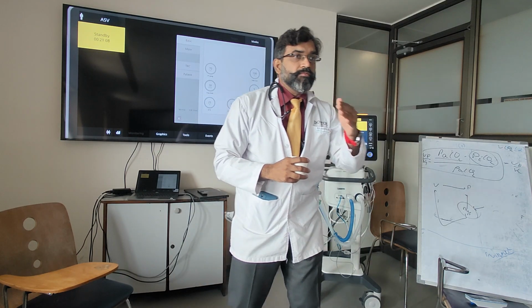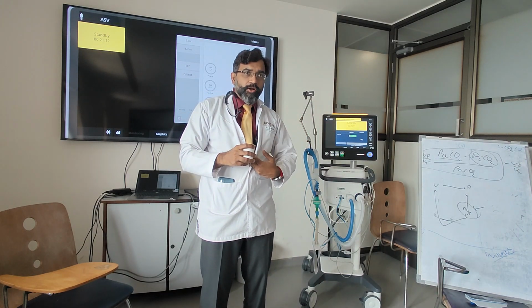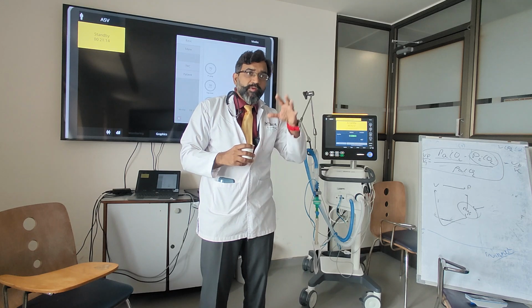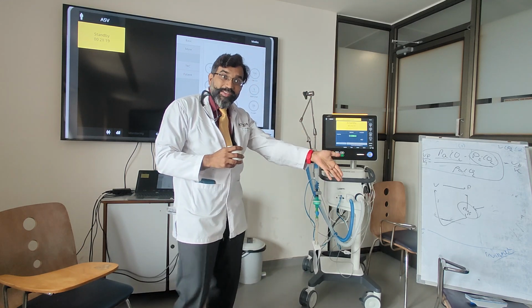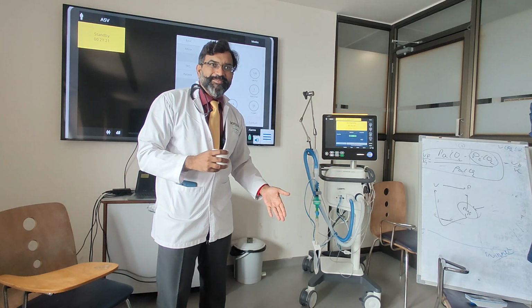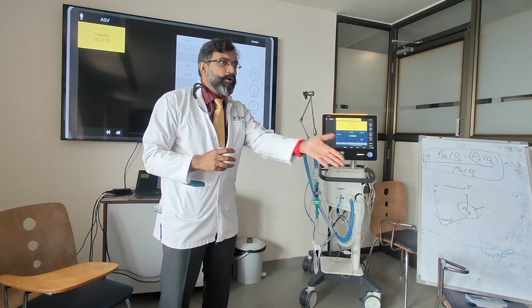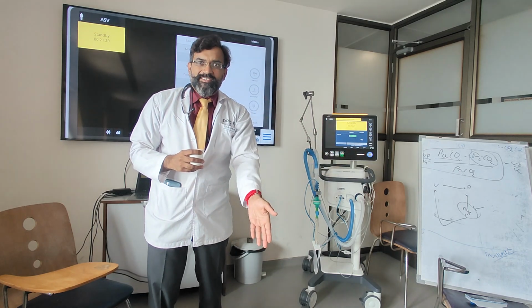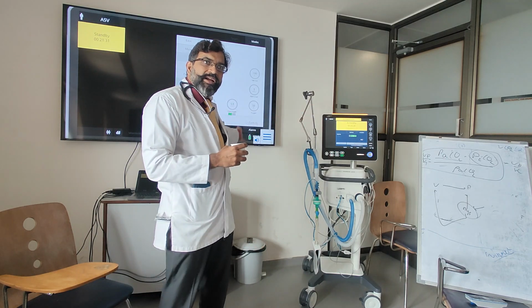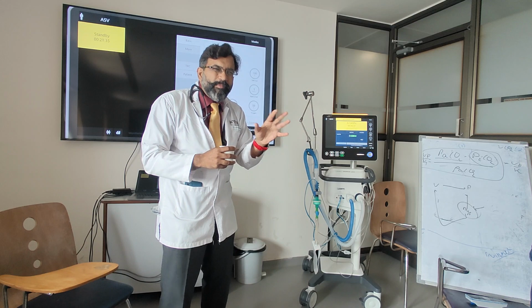There will be a problem. Because what has happened in cardiac surgery is you have had a sternotomy, and the FRC has gone down. Once your FRC has gone down, this ventilator does not know the FRC has gone down. Ideally, you want the FRC to open up again. He has undergone anesthesia, and FRC drops by 30%. You will put 100% minute volume. It will over-distend the existing alveoli, and will not be ventilating properly.